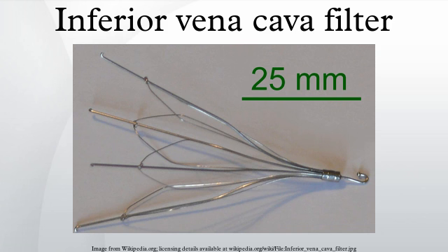Newer designs and developments in techniques mean that some filters can now be left in for prolonged periods and retrievals after a year are now being reported. This would include the ALN, Bard G2 and G2X, Option, Tulip and Select filters.